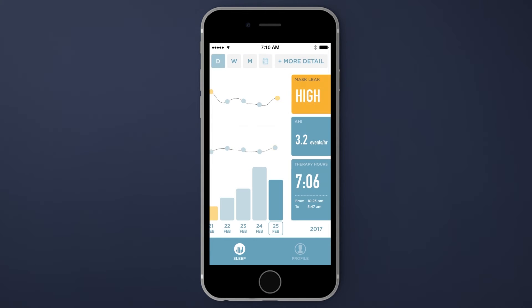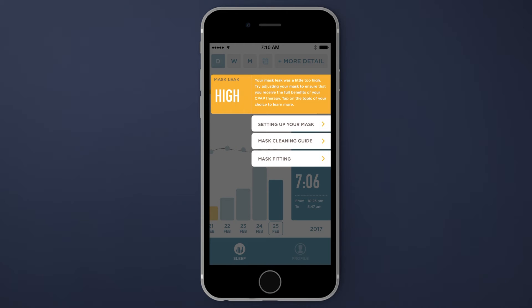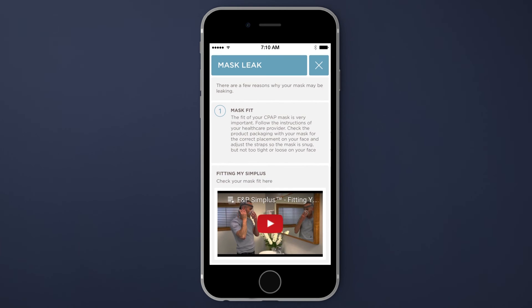By tracking your therapy metrics, SleepStyle can help to identify potential problems that you may encounter with your CPAP therapy and provide you with troubleshooting tips as to how these might be addressed, giving you the confidence to succeed with your CPAP therapy.